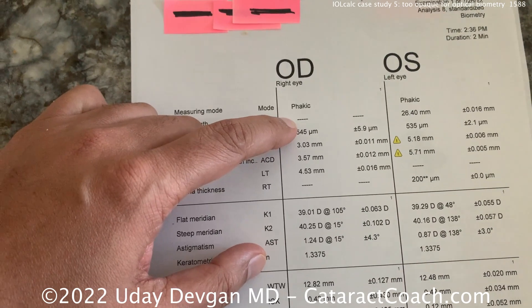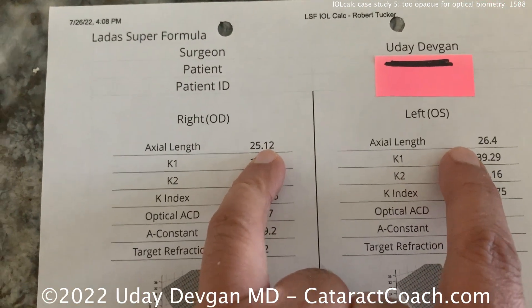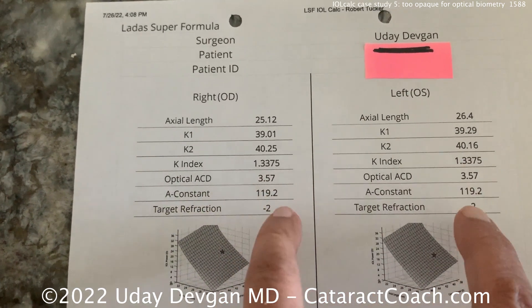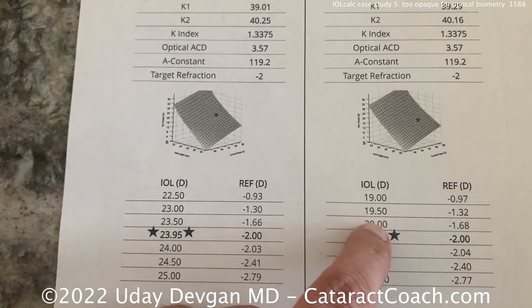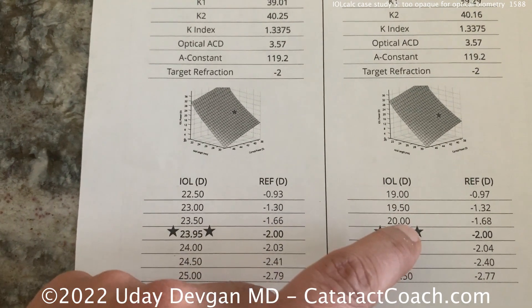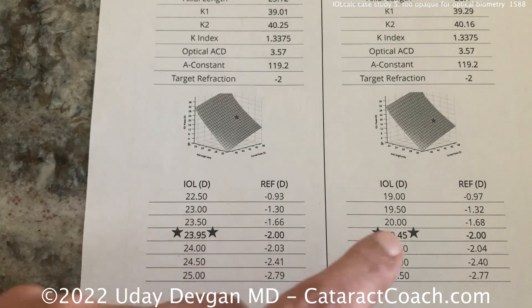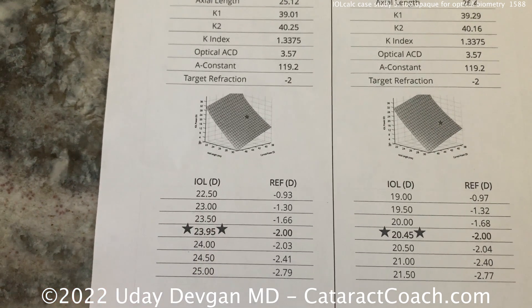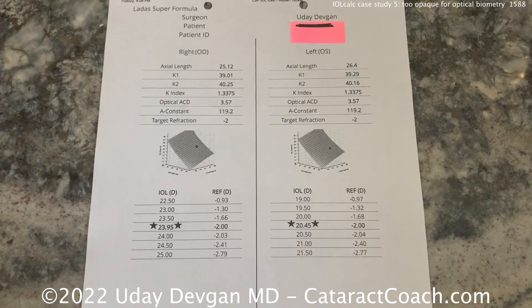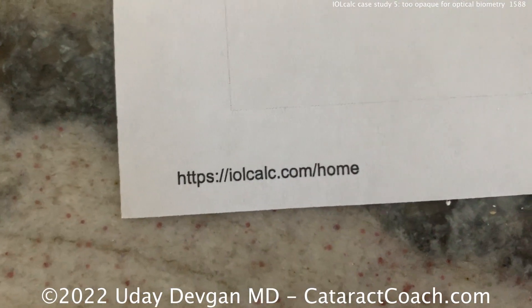I still don't have the right eye axial length, so I do the A-scan again and get 25.12 — very consistent. For the calculations, I use 25.12 for the right eye and 26.40 for the left. I copy the ACD from the right eye for the left eye calculation and aim for minus two in both eyes. Since the 20.0 diopter lens gave us minus two in the left eye, a 23.5 should give minus two in the right. These are the important teaching points for what to do when patients have a very dense cataract and you're unable to get an axial length — using the Ladas Super Formula with AI on iolcalc.com.